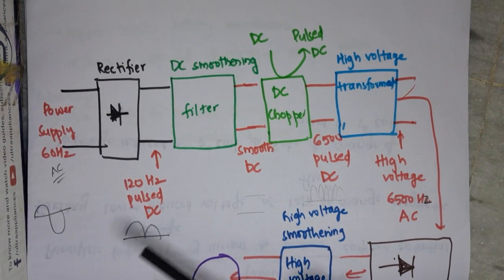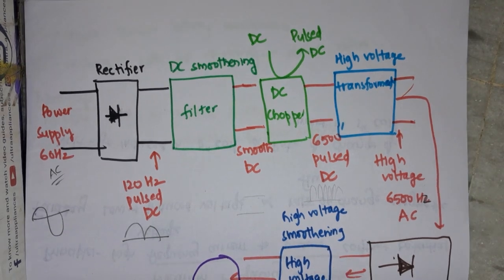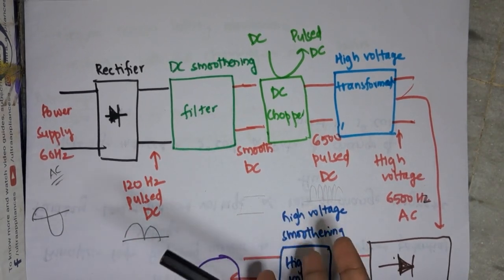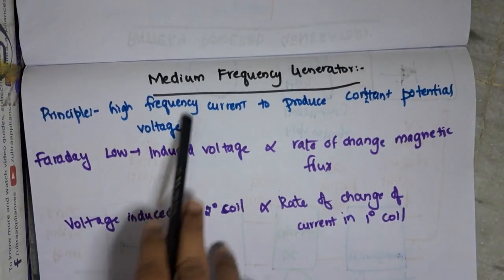Okay, this is the important thing. Next, what does this medium frequency generator do, and what is its connection with Faraday's law? See, what is Faraday's law?